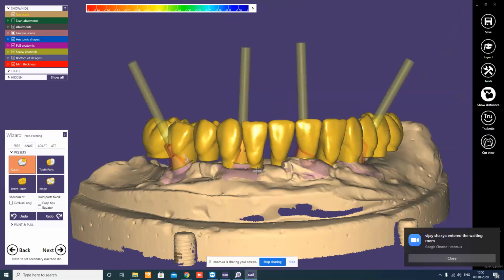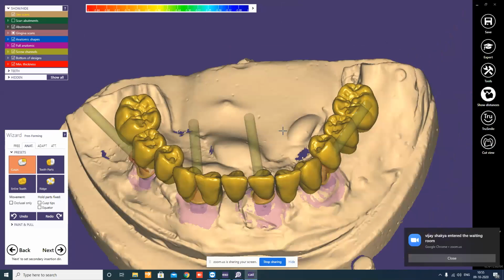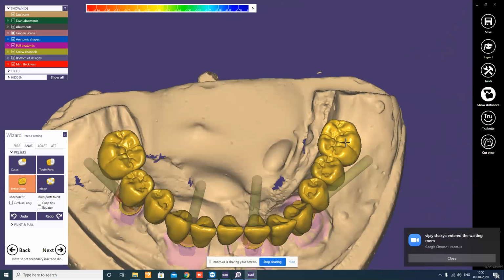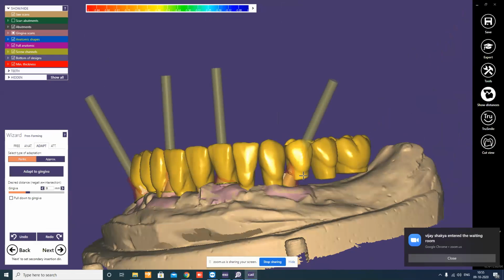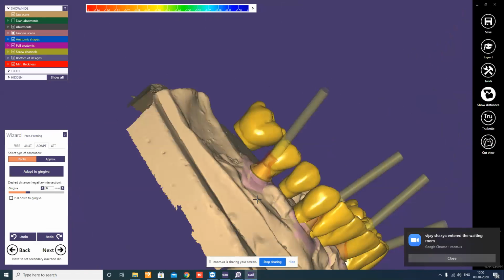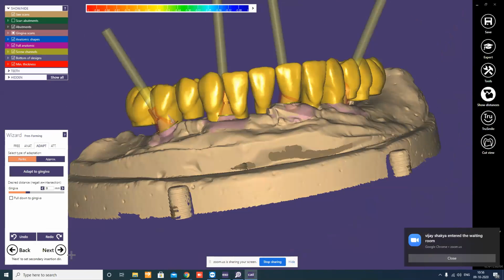And we can individually again design the teeth what we want. Suppose we find this more tilted lingually, so we just bring it here. This is for show. It may not be tilted, but just to understand what are the tools we can use to change whatever is required. It's more of an understanding of your armament. Then you can adapt to gingiva.